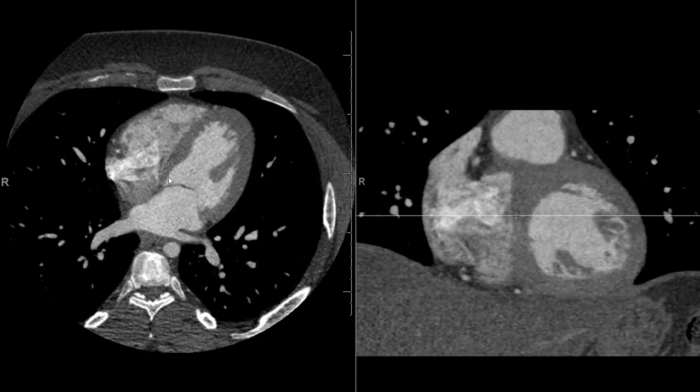Here I have an axial and a coronal format of a coronary CTA. Contrast is given and then scanned at the right time when you have a lot of contrast in the heart chambers as well as within the coronary arteries.